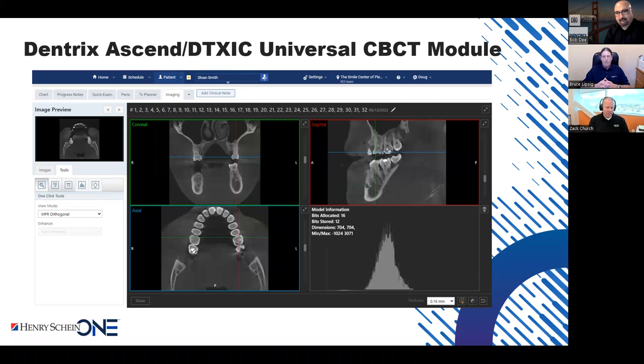And you mentioning Henry Schein, it brings stability to Dentrix Ascend, and Ascend is the product of the future, and there are a lot of expectations, a lot of new features, as you mentioned, coming into Ascend, clinical features, administrative features, financial features, scheduling features. But as you know, obviously today we're focusing on imaging, which is second to none, especially when it comes to cloud.